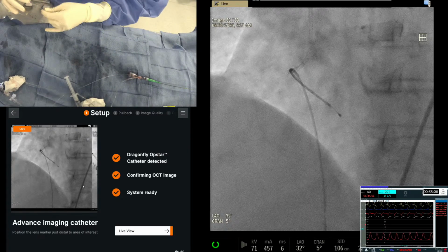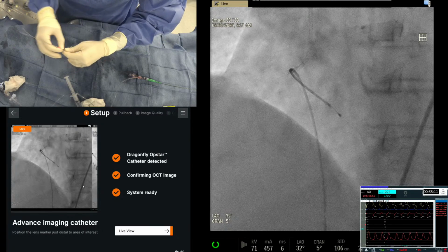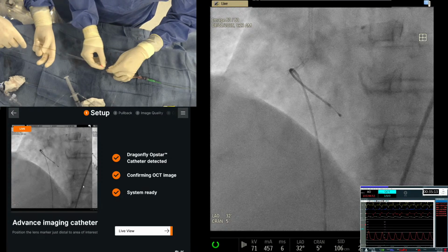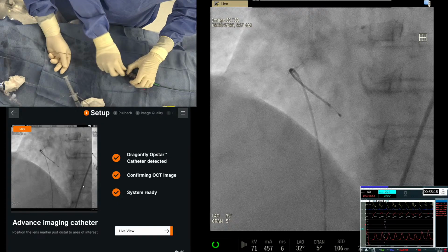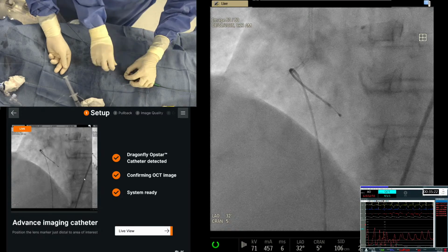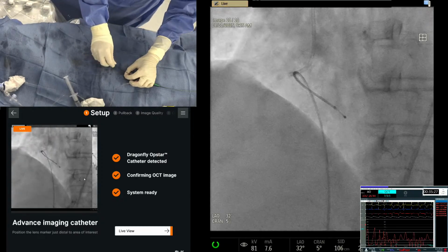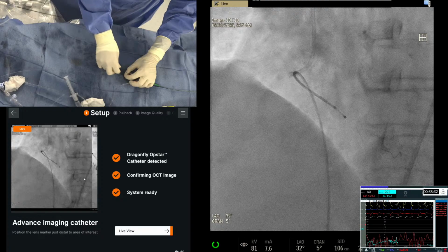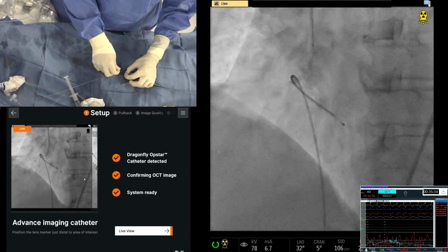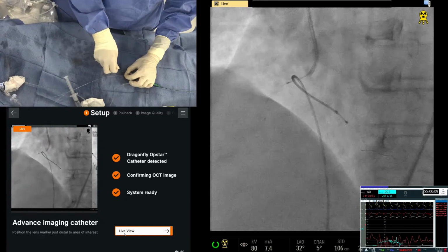We are going now. Now hemo, yes, by the side. Despite all that, it's still damped. Now, what happened is because we are using dye, not saline, the images we get from saline are not the best. That is one reason we don't like it. So when possible, it has to be dye. You cannot use side holes, and because of that reason, maybe we are seeing these EKG changes and all that. So what we are going to do is, once we are there, let us see. One, will the catheter go through the lesion? Closer.